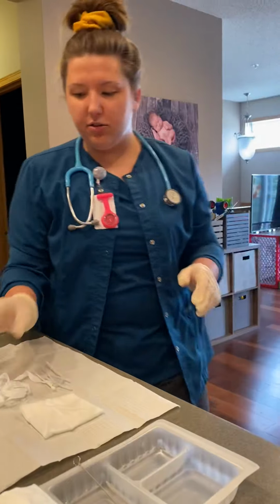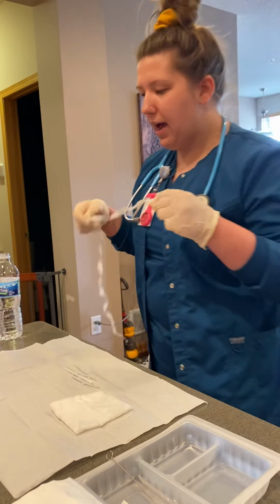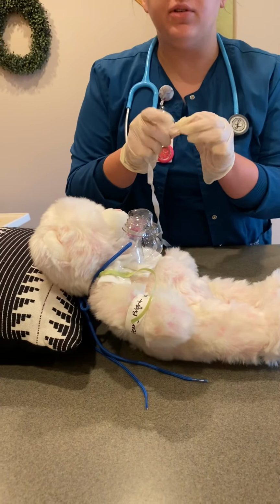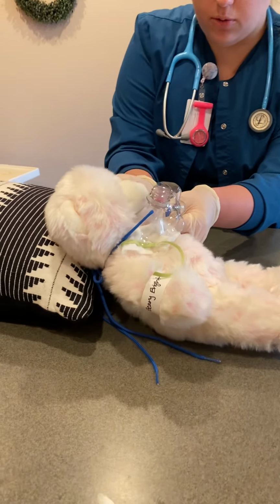So now I need to replace the ties around the trach, and I would do this by replacing them without taking the old strings off. So I'm going to do that now.